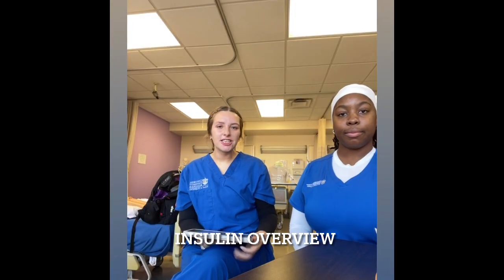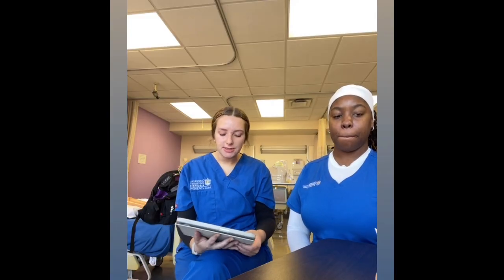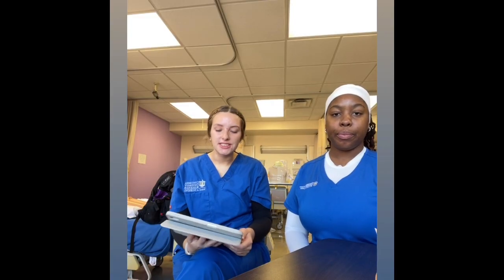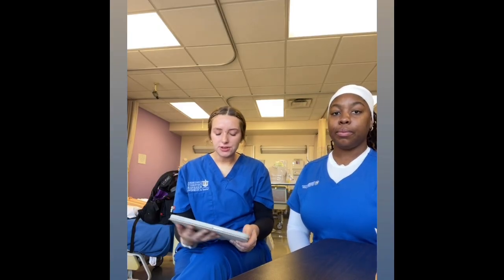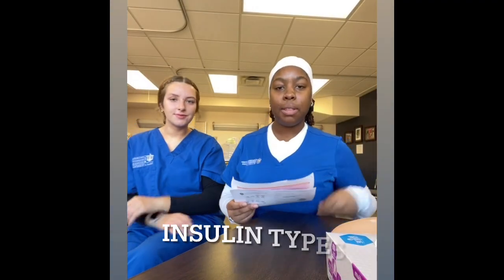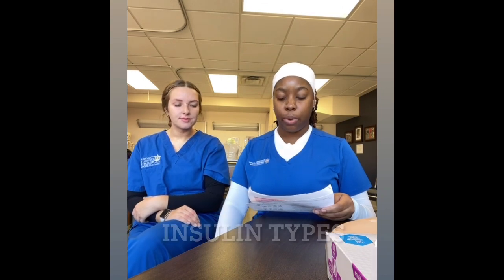Alright, now it's time to talk about insulins real quick, and then we'll be getting into the skill. Just a quick little overview. There are many different types of insulin and each works at a different speed, so it's important to know which insulins you'll be giving and when to give them. Today we'll be demonstrating how to draw up and administer NPH and regular insulin.